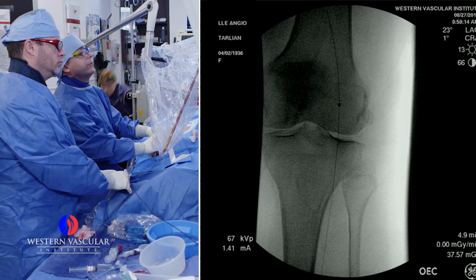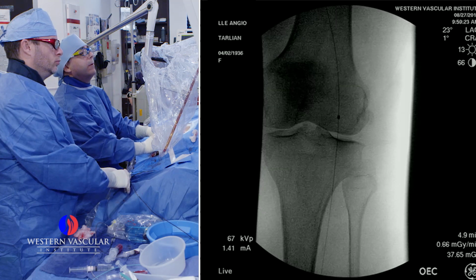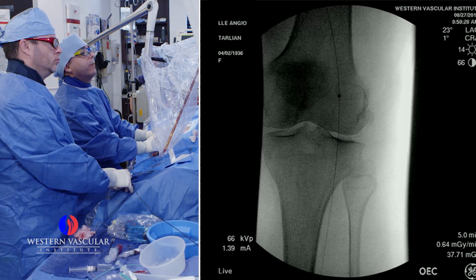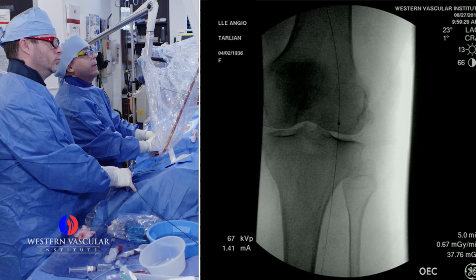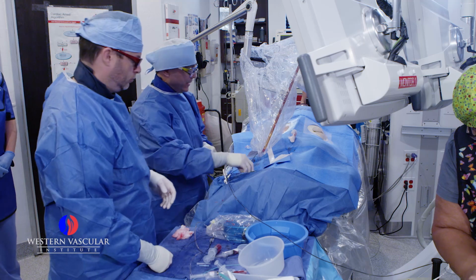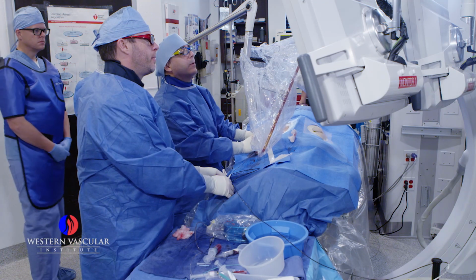And we'll do several passes here. Five. All right, let's go up a little bit. 60, 60. Now I'm going to increase the power on the laser. 60, 60. Go live.